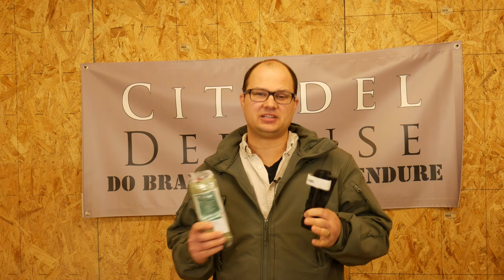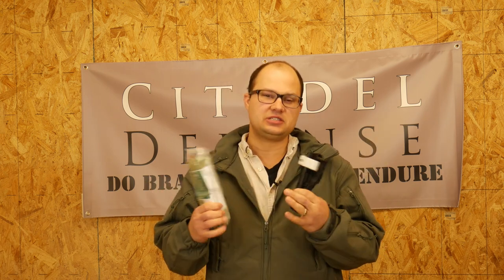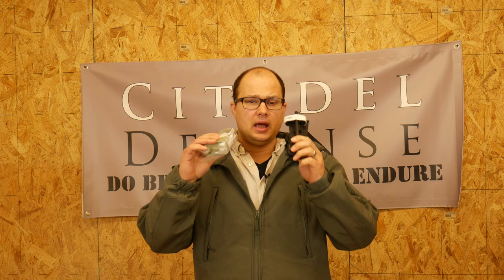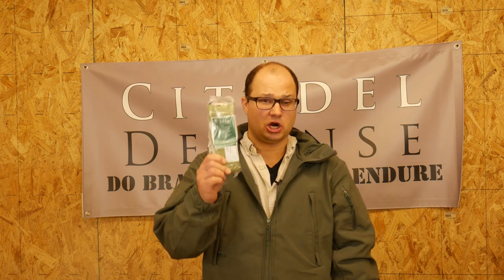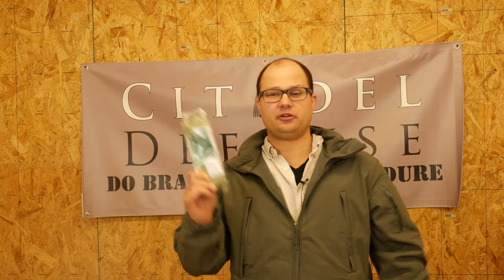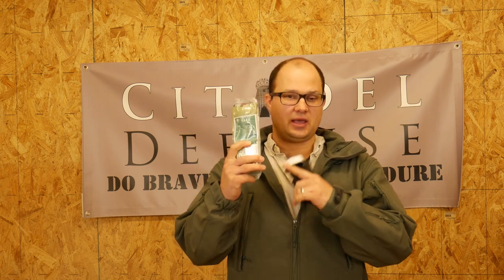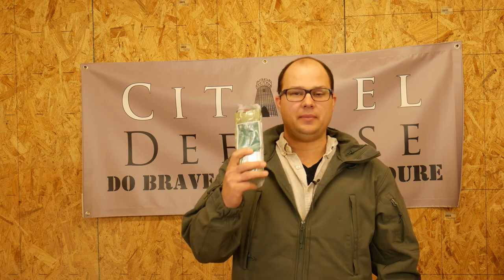I've been experimenting recently with how to solve that problem, and I've kind of come up with a solution that at least works during the colder months. First of all, I use the Dark Angel Medical Kit. I've taken their classes, would recommend them, love their products. This is their refill kit — this is what I use for this solution.